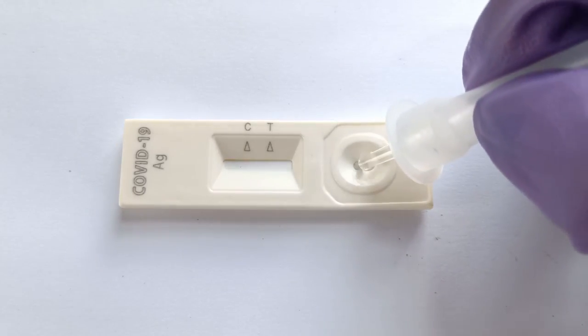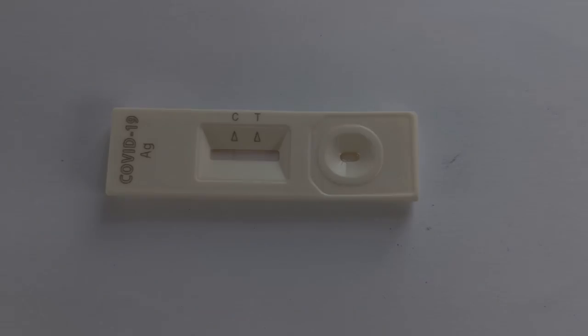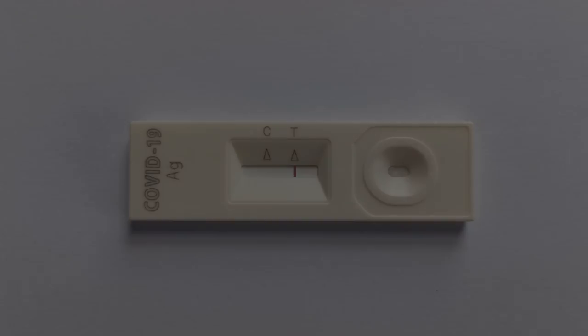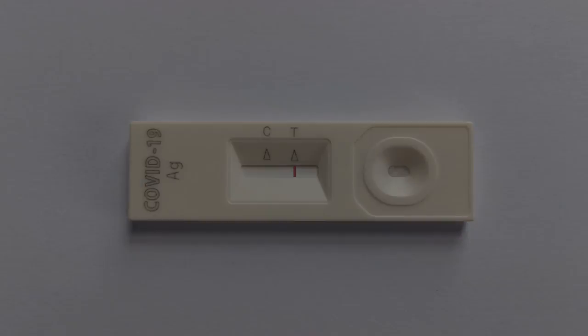In the case of a negative test for COVID-19, only the control or C spot shows a single purple line. A purple line showing only on the test or T spot but not on the control or C spot is considered an invalid test.